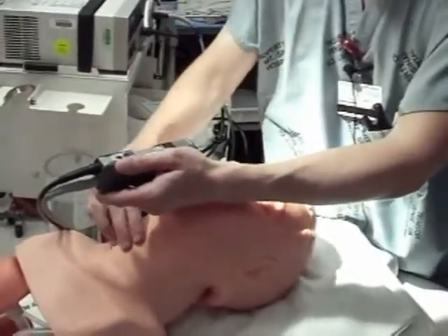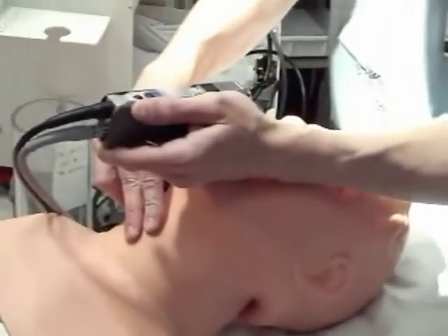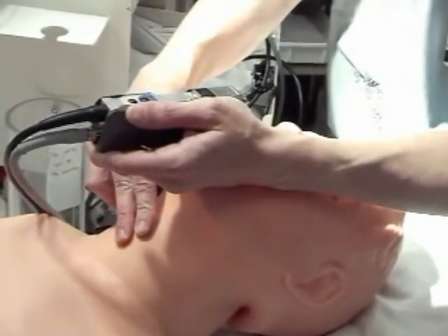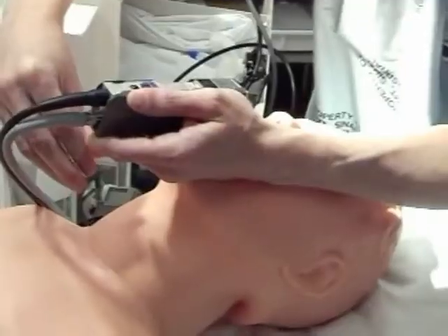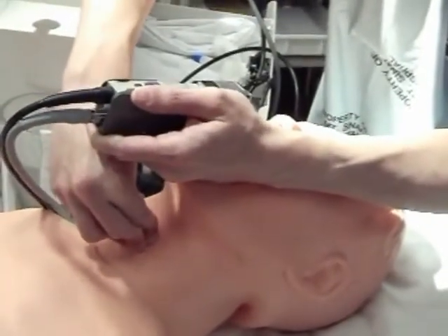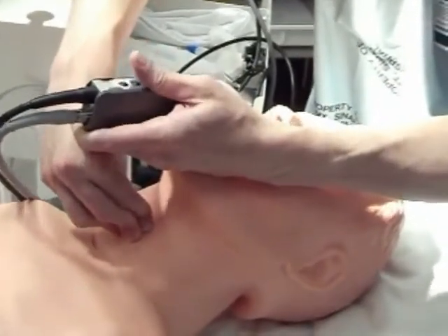At this point, this hand goes to the thyroid cartilage. What you're seeking to do is take the potential space of the vallecula — which you see right now — and turn it into an actual space. That happens by pushing down on the thyroid cartilage, converting the potential space into a big, actual space. Now you have a huge vallecula. The next step is to make the vallecula an actual space and slide your blade into it.